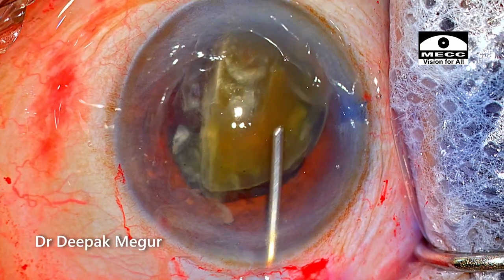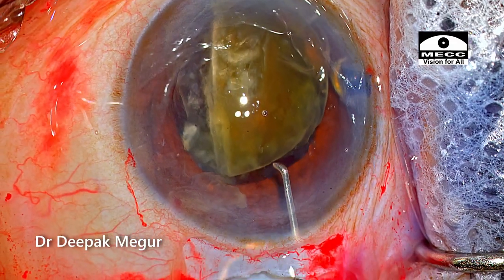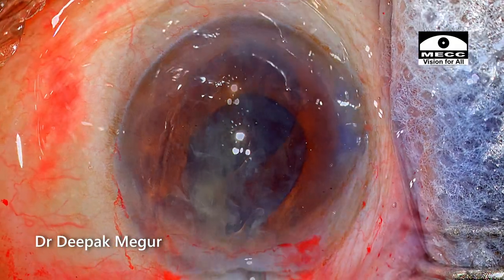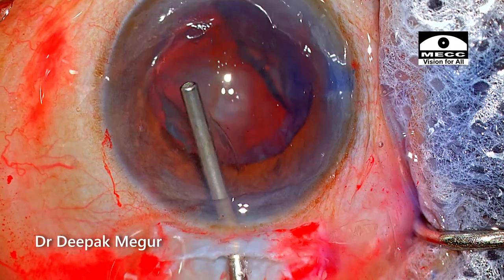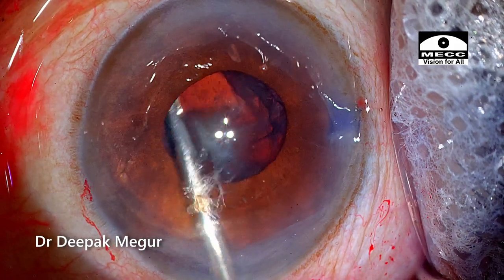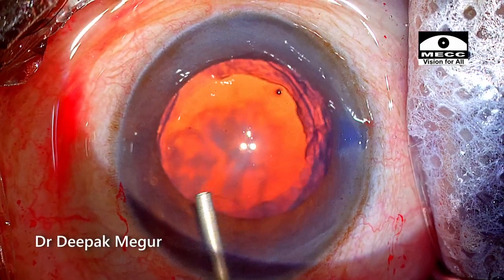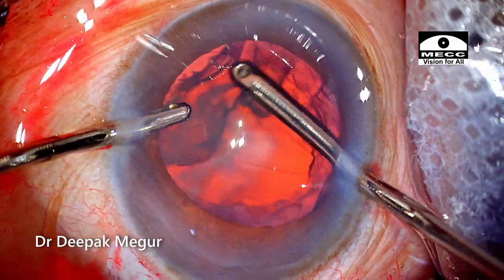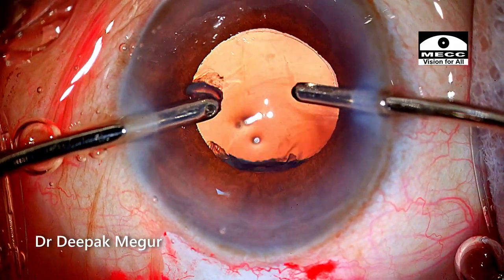The OVD is refilled and the second hemi-nucleus is also extracted out. The fundamental goal is to extract the nucleus without damaging the corneal endothelium — that should be our primary goal. Whenever we learn a new technique, we must never forget that the fundamental goal is always protecting the intraocular structures. We must use whatever means we can to avoid mechanically damaging the endothelium. Endothelium is priceless, so do whatever you can to maintain its safety.